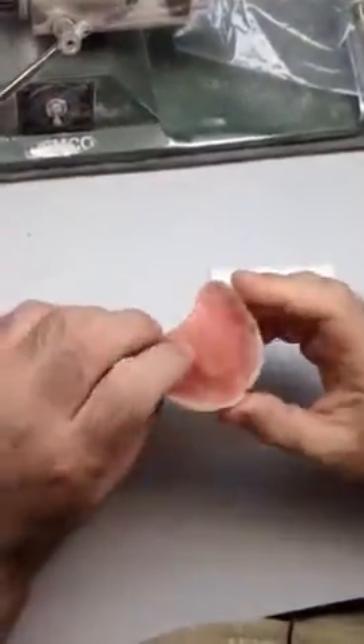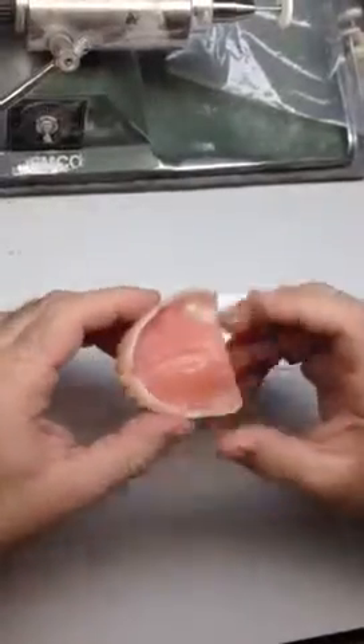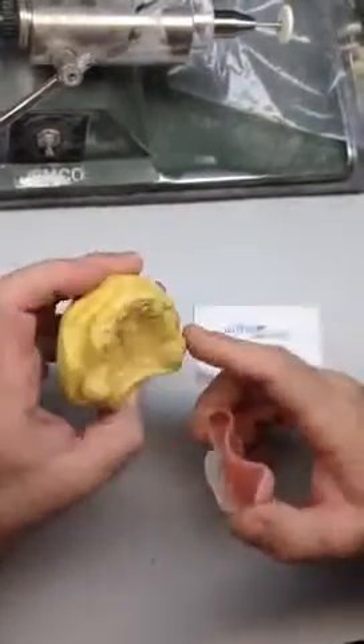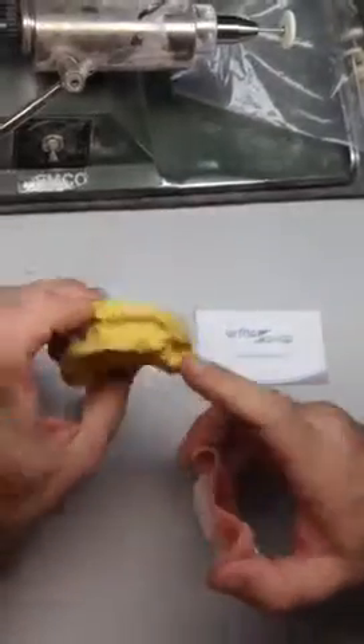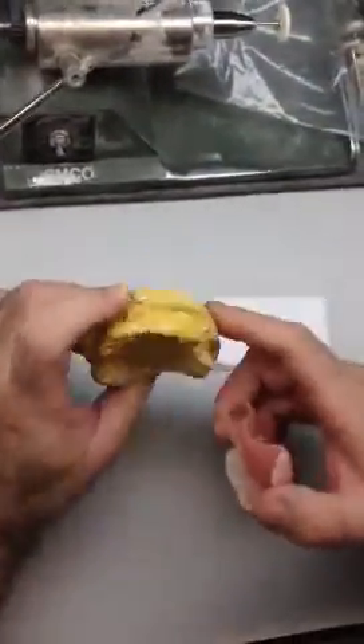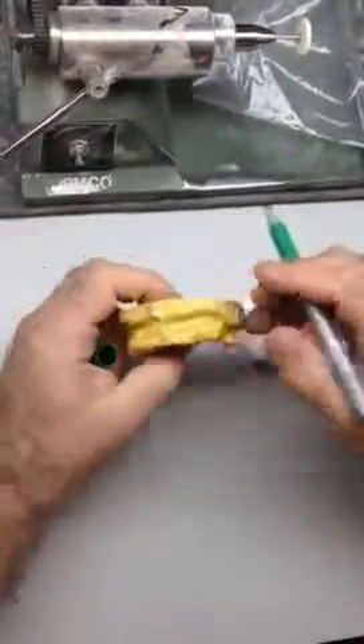Good morning, everybody. We've shown the results of the new experiment where we have produced the full denture. The patient has deep undercuts in the area of tuberosities, in retromolar tuberosities area, in retromolar area, and to bypass its fresh extractions.